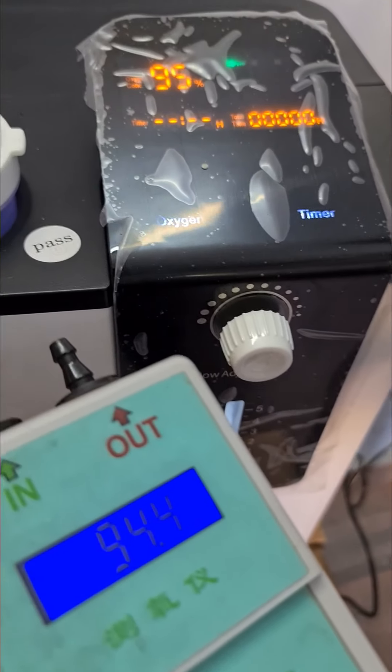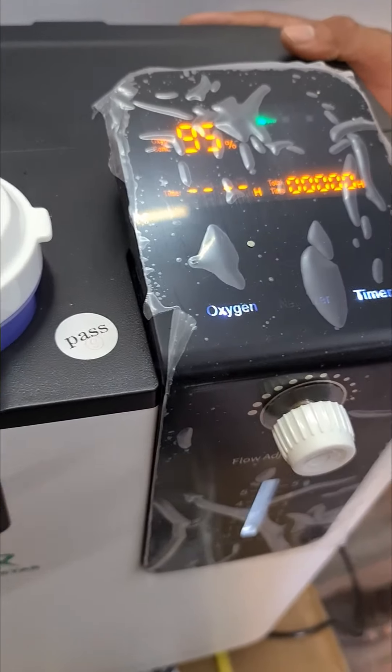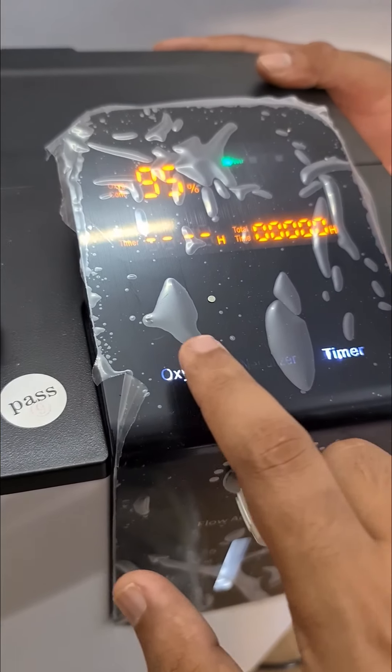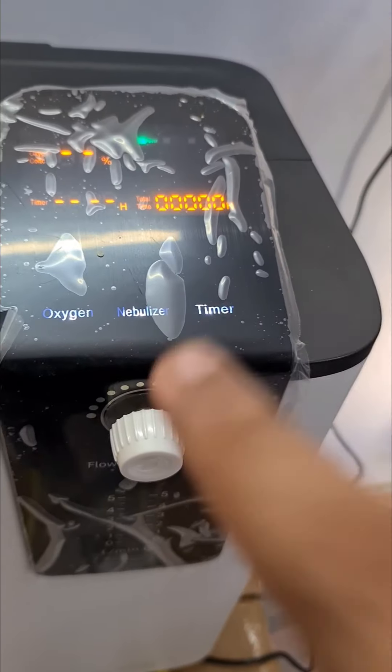Now I will teach you about the other functions. Whenever you want to stop the oxygenation, just click this once. Automatically the compressor will stop and the machine will come to a rest state.